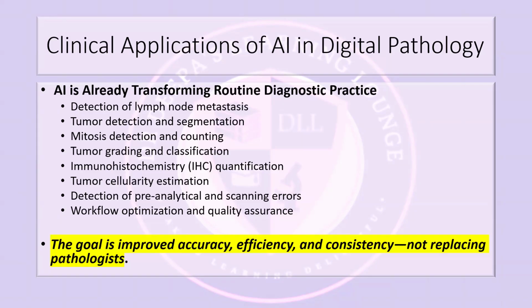Many times the acceptability of inter-observer variation goes haywire when you're actually doing this, and two pathologists almost never report at exactly the same level. That is where automated mitotic counting improves the reproducibility and provides objective quantitative data that supports tumor grading perfectly.